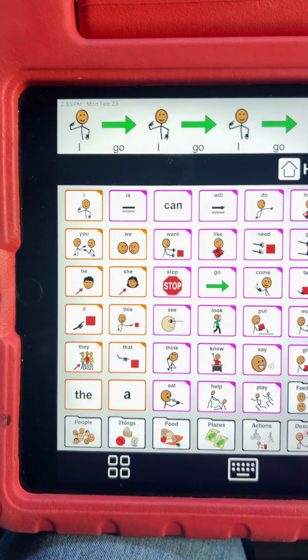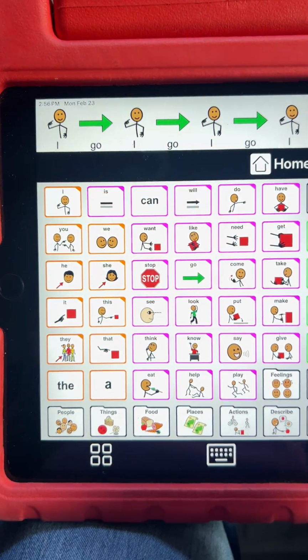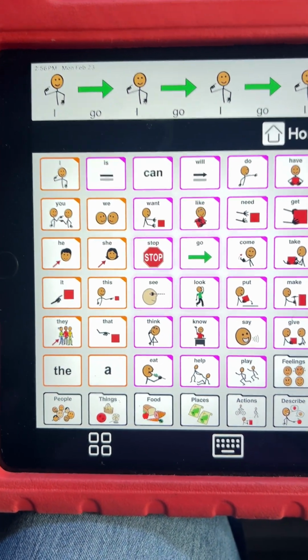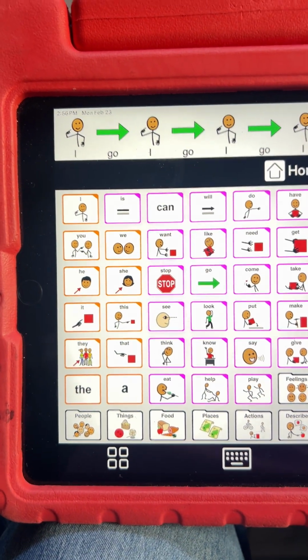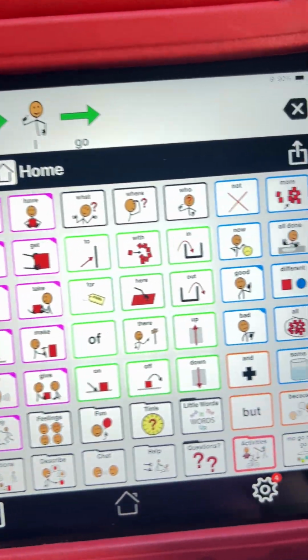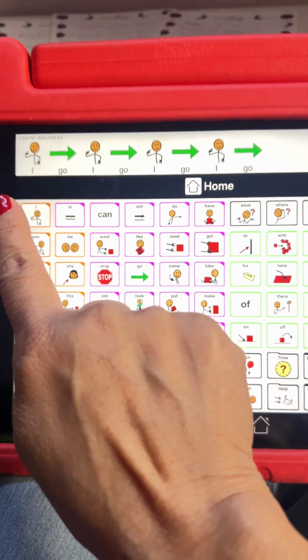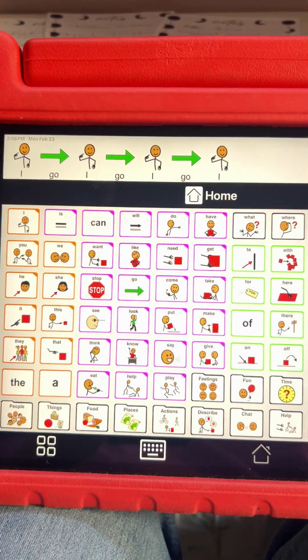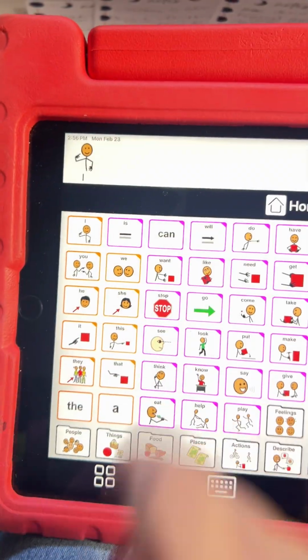When you're doing this repetitively throughout the day, there's a couple things that you're doing for yourself. You are memorizing where these buttons are, right? And you can play with it throughout the day, but focus on a couple of phrases, not full sentences, just 1 to 2 words of direction, activity, preference, and go with that so that they are hearing it, right? And then over here, sometimes your client will hit it, and if you have this whole space up here covered, it's going to say all of that.